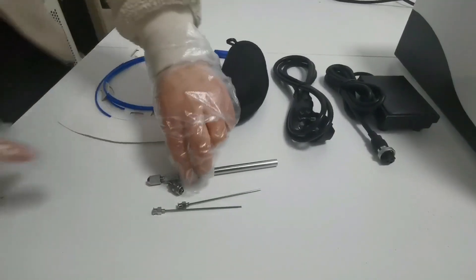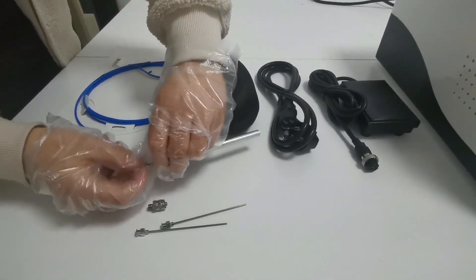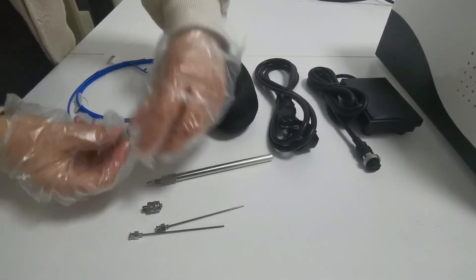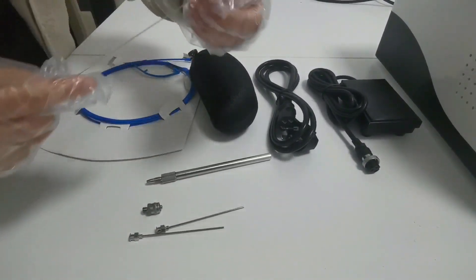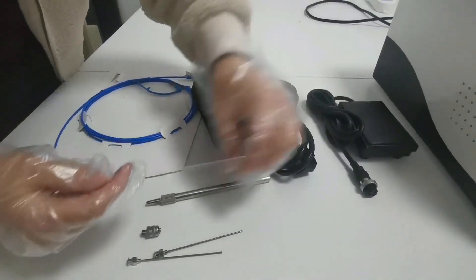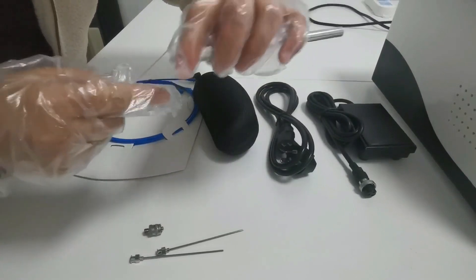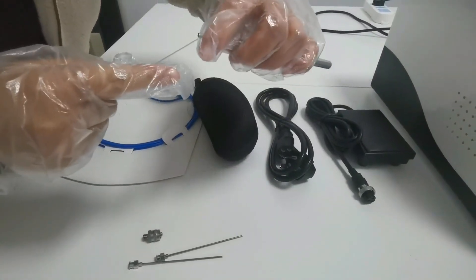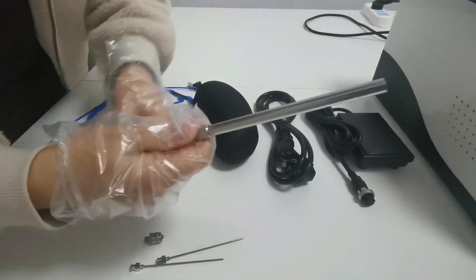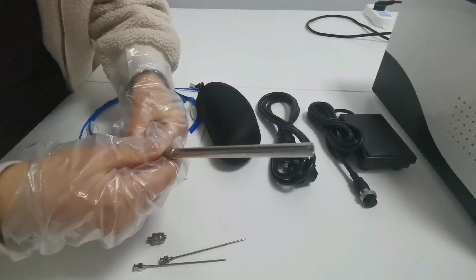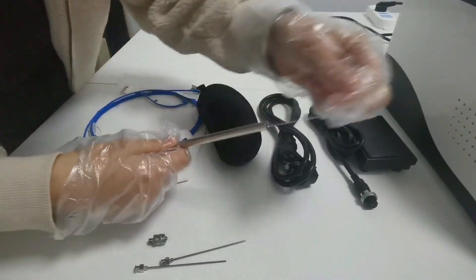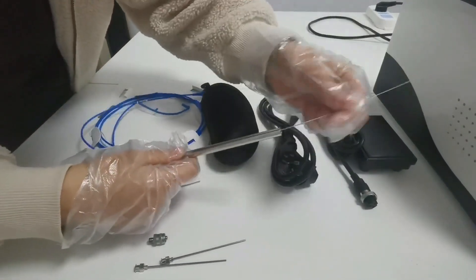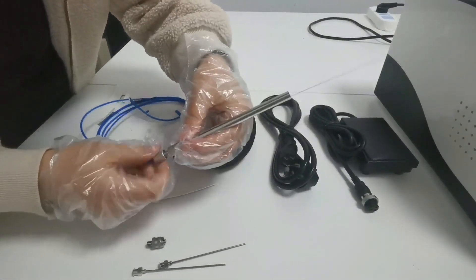This is the operating handle, which is set together with the lipolytic dissolving optical fiber. Screw down the lipolytic dissolving handle from the middle end of the handle, insert the optical fiber from the tail of the handle, and then insert it into the front end of the handle, and tighten it. At this time, the optical fiber can move. Tighten the tail of the handle to lock the optical fiber.